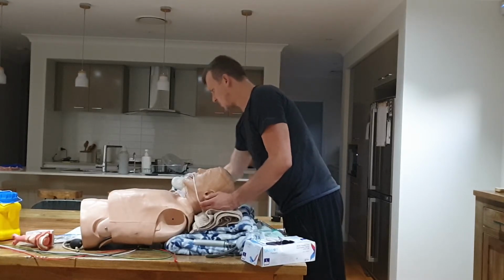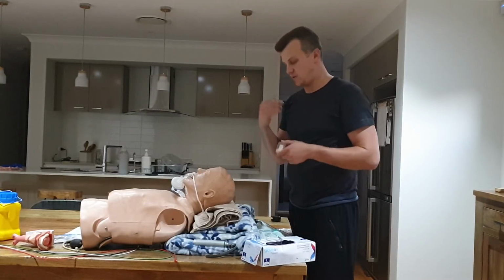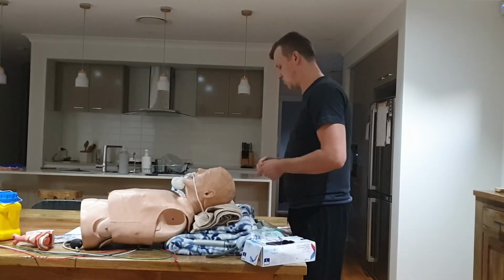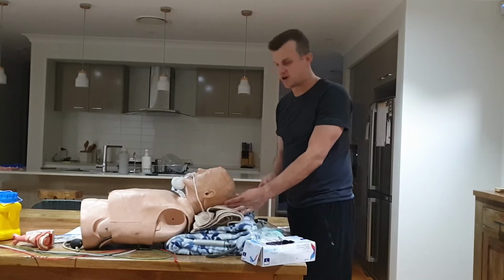Now they do have a few different capnography devices. You have a chemical reaction one, which just changes colour when the patient breathes out. You have a little portable one which you can connect after the filter there, and it gives you a readout and a waveform as well. Or the other one, you use a CO2 sampling line, which connects to a LIFEPAK or a monitor.